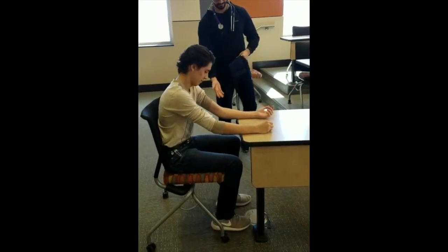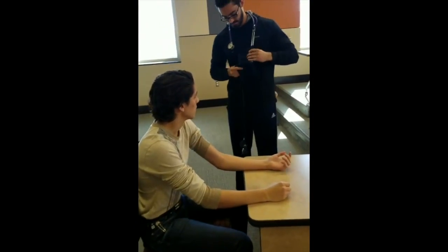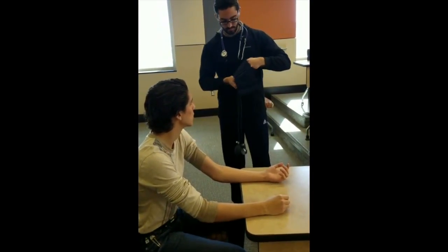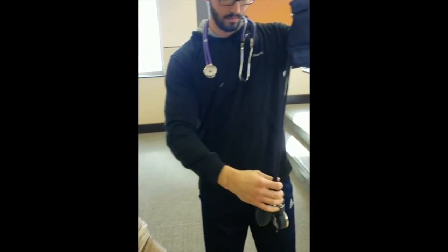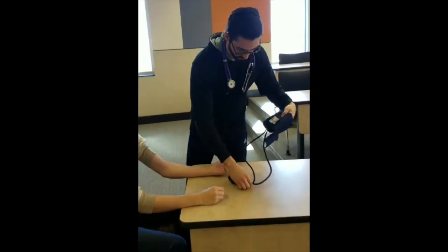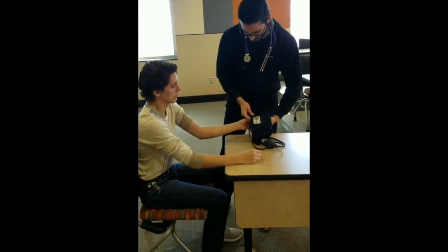Make sure to check for proper cuff size. The cuff should not be too large or too small. 2 fingers should fit in between the subject's arm and cuff. Make sure to identify the artery mark on the cuff and align it with the subject's brachial artery. After this, wrap the cuff around the subject's upper arm.